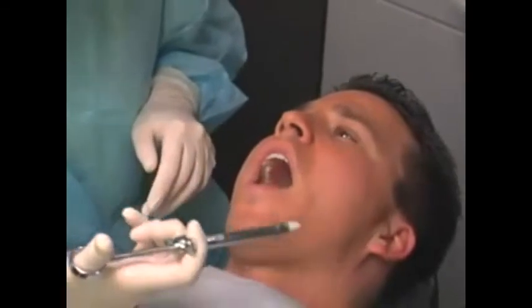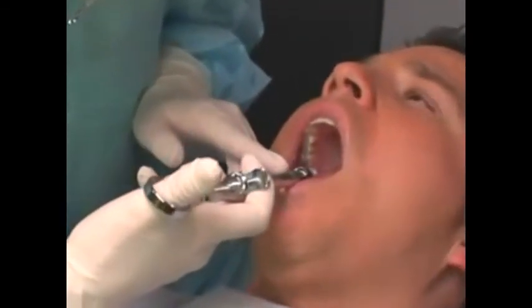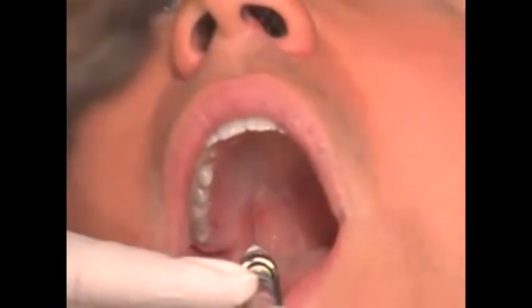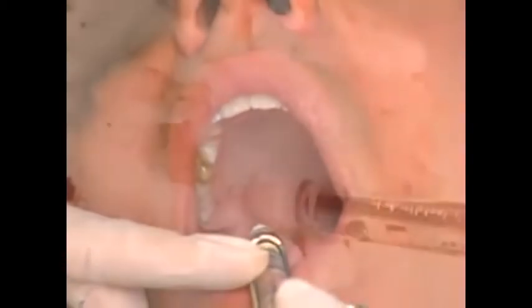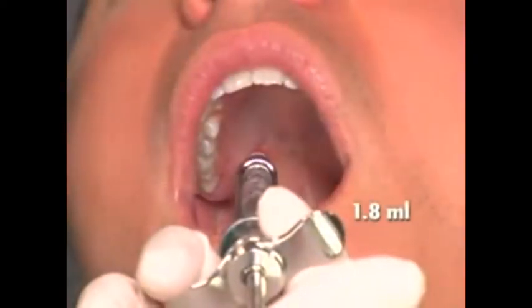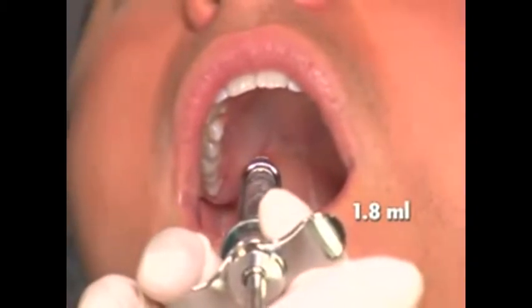Following completion of the greater palatine nerve block, the needle is inserted into the soft tissues over the greater palatine foramen. The needle is inserted into the greater palatine foramen and advanced to a depth of 30 millimeters. Following negative aspiration, 1.8 mLs of local anesthetic is deposited slowly over minimally 1 minute.